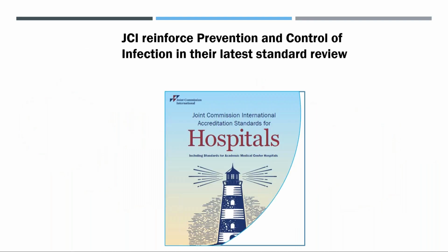Now, JCI reinforces prevention and control of infection in their latest standard review. JCI is the Joint Commission International. The Joint Commission in the US accredits hospitals for billing from the federal government, but as well they have an international accreditation association, just as a way of demonstrating hospitals are following guidelines, not only in infection prevention, but all standards related to improving patient safety and improving patient care.